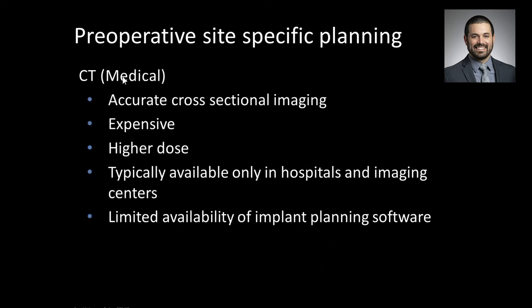CT, so medical or multi-detector CT, is also an option, which is very accurate. However, it's more expensive and higher dose and typically only available in hospitals and imaging centers. And also, the data or image formatting may or may not work well with specific implant planning software.